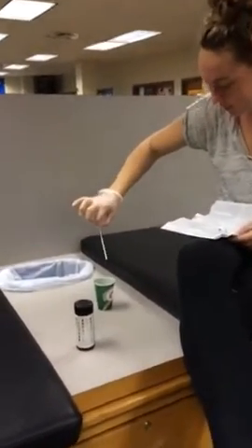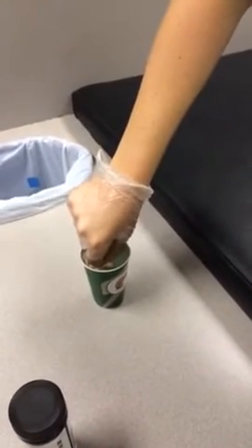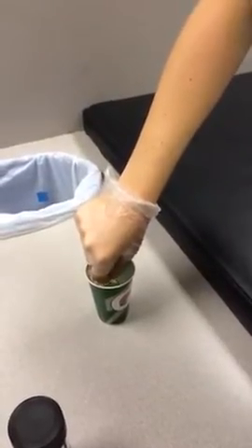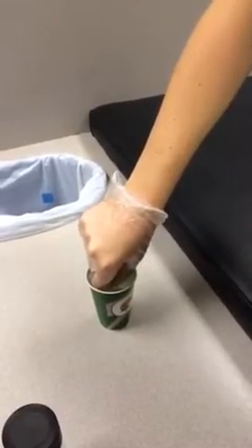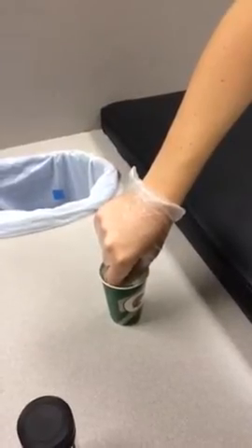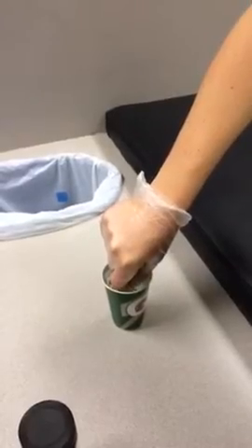After you've dipped the strip in for about 60 seconds, drag the edge of the strip against the container rim. Apparently the strip should be dipped in for a full minute — probably should have done that first.